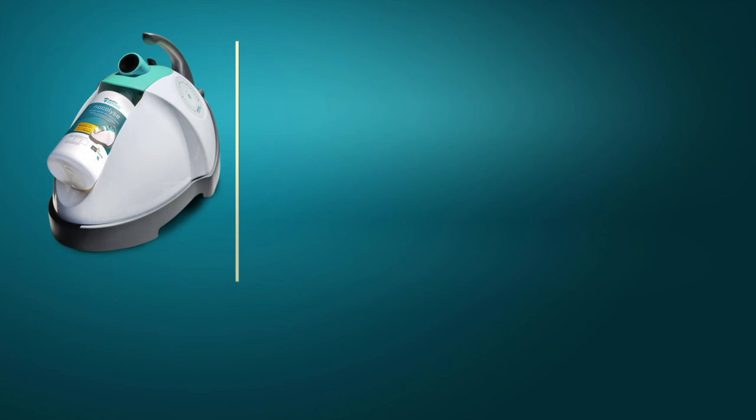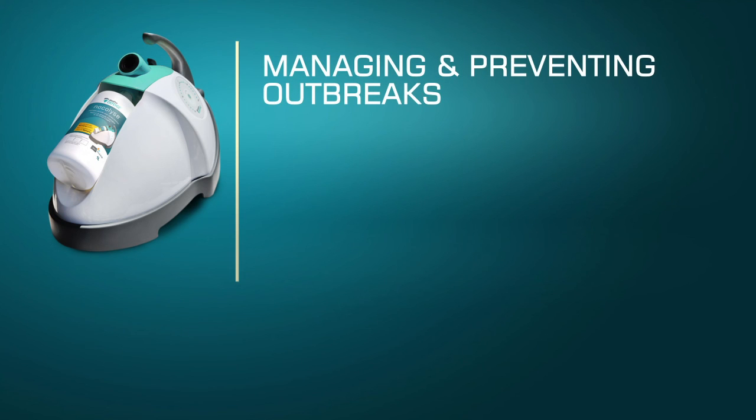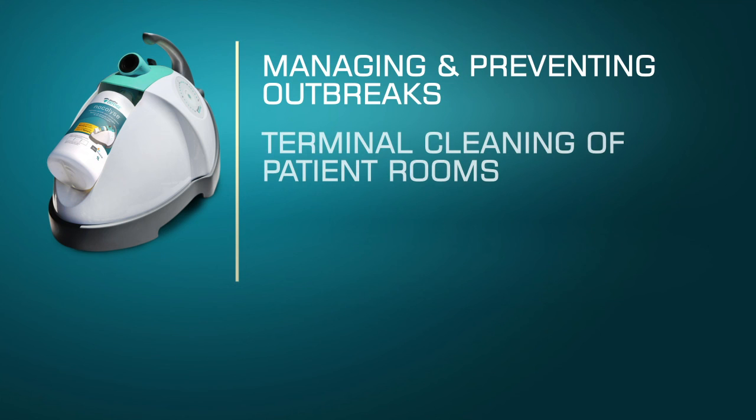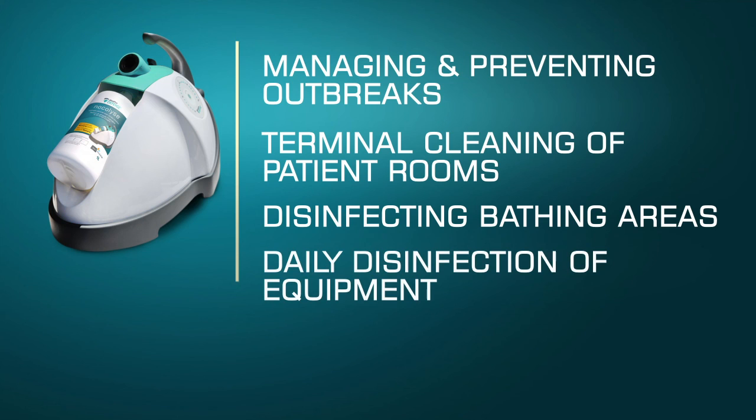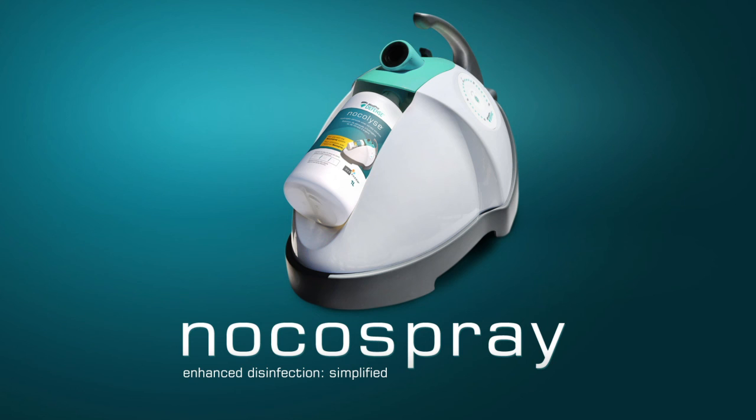This allows Nocospray to help you set a higher standard for managing and preventing outbreaks, especially in high-risk areas and rooms where infections tend to recur, for terminal cleaning of patient rooms, for disinfecting bathrooms and bathing areas, and daily disinfection of equipment rooms. When used as directed, this system will help prevent and reduce outbreaks within healthcare settings, or in any enclosed space challenged by pathogens such as influenza, MRSA, or C. difficile. Nocospray is disinfection, simplified.